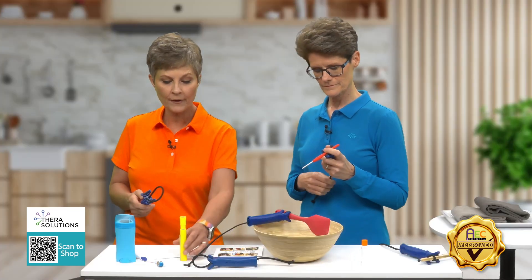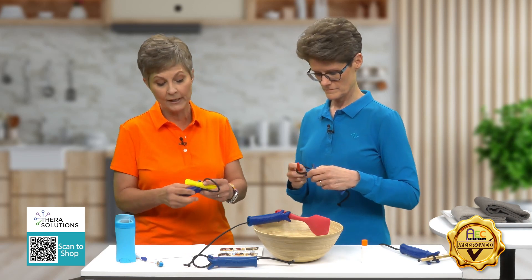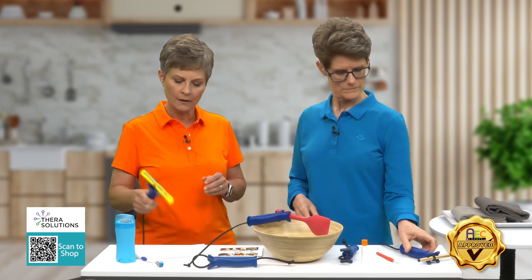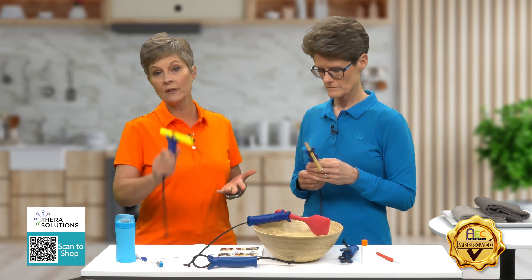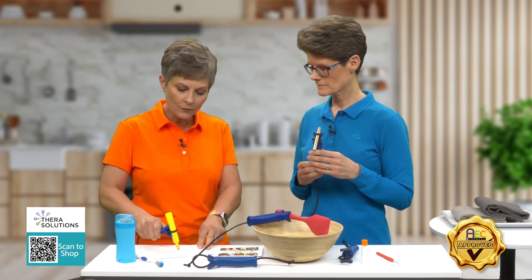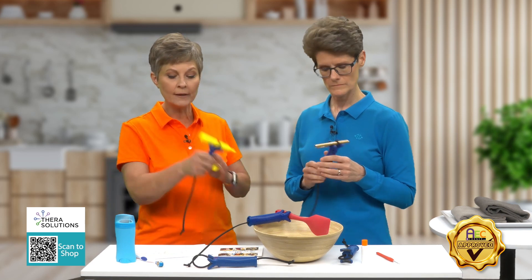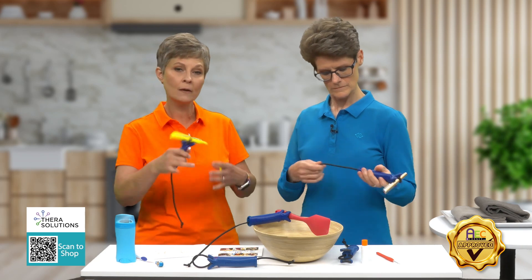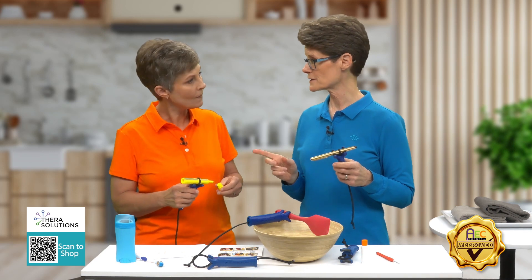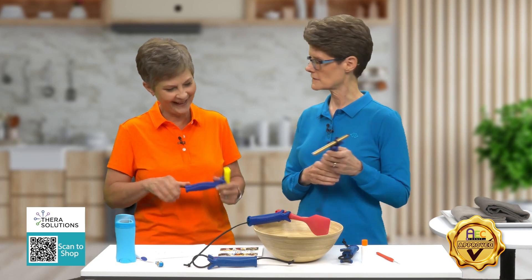The other thing we like about it is when you're using any utensil — let's say a writing utensil — you can actually use this in a horizontal position, but you could also use it in a vertical position too. You can use it to write with. If you were writing on a whiteboard, you could move it up into this position, and a lot of times people may be limited in their motion, so they may have to use it in one position versus the other. I would like to use that on a bingo dauber — yes, that is another thing you can use.